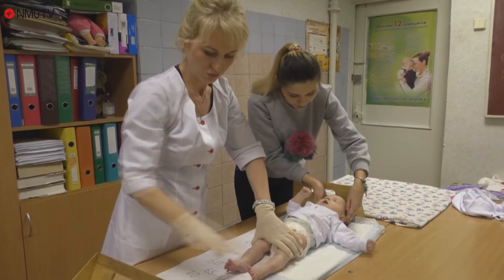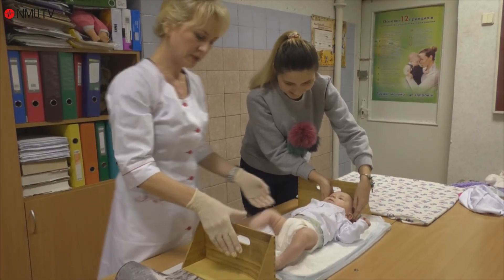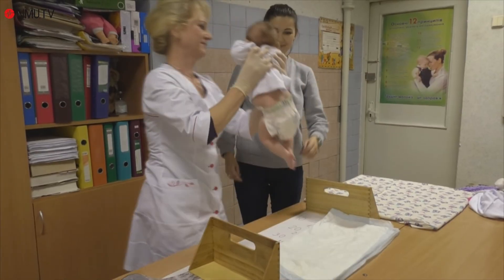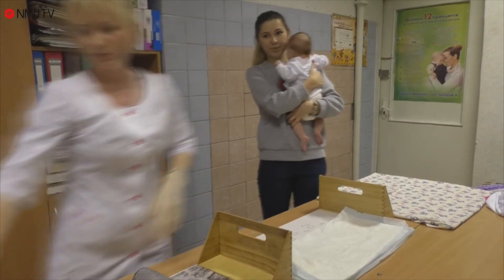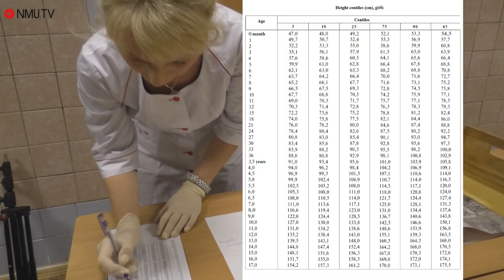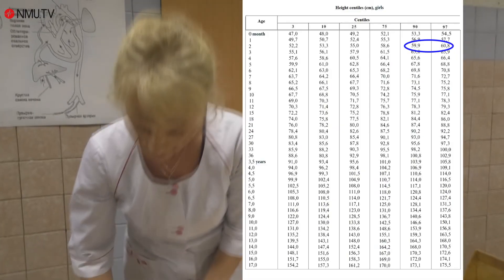Stretching the legs of the baby, lightly pressing on the knees and tightly applying the movable bar of the growth meter to the heels. The obtained figure corresponds to 60 cm. Write the indicator in the measurement sheet and evaluate the results. The result is between the 90th and 97th centiles, which corresponds to high physical development.